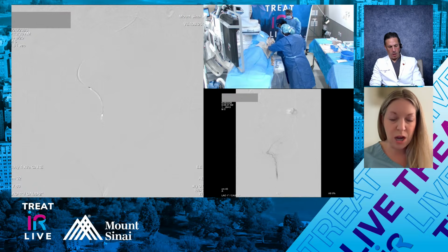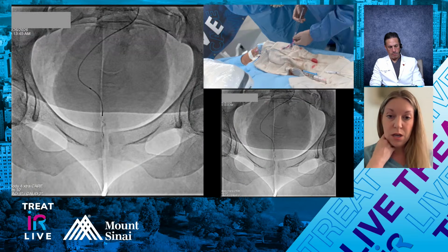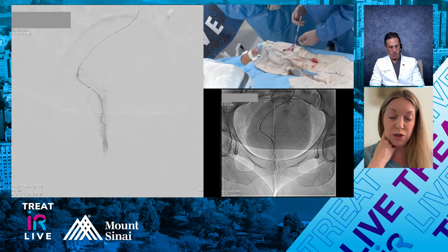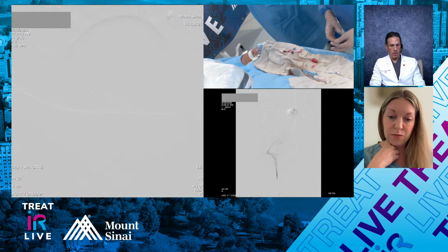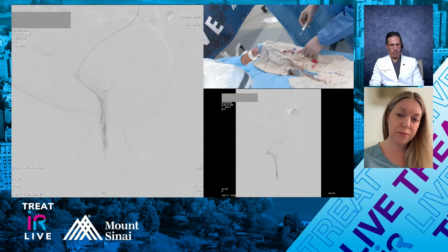But yeah, I've done a 2.0 as well in some cases. It might be hard, Jay, to get the 7 to 9 through a 2.0, I would imagine, right? Yeah, that could be a little sticky. I'm not gonna really push the 5 to 7s through there, I think. The issue wouldn't be the coil; it would probably be the particle. All right. What do you guys want to use for coils here as you think about the next step?